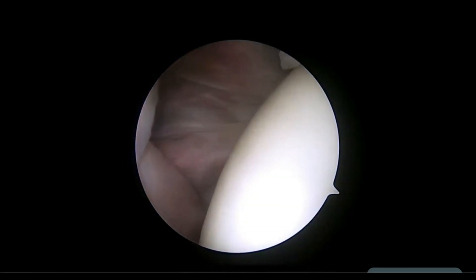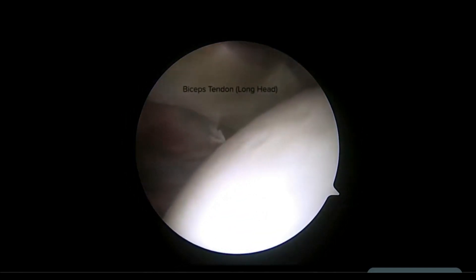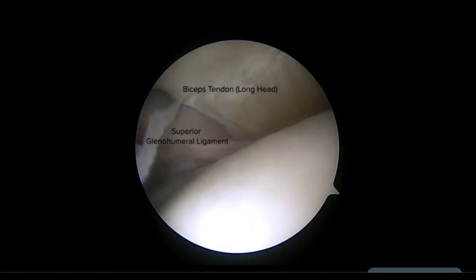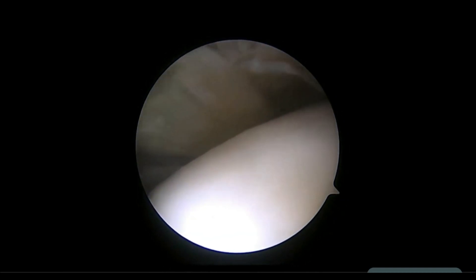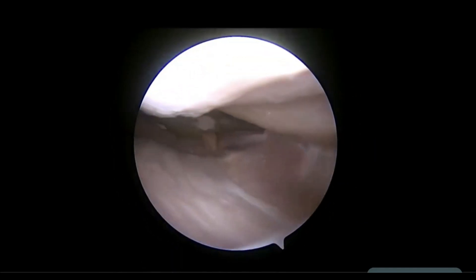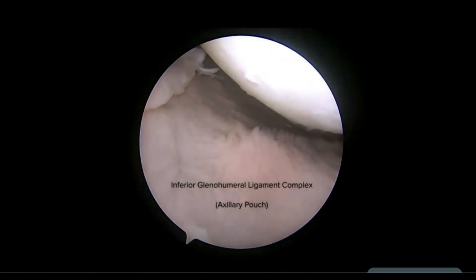Bringing the view back anterior, the rotator interval and rolled tendon of the subscapularis are visualized. The long head of the biceps is then seen as it projects into the joint from the bicipital groove laterally. In this view, you can also appreciate the superior glenohumeral ligament as it attaches to the humerus on the undersurface of the biceps into the groove. Finally, as the camera is driven inferiorly, the axillary pouch containing the inferior glenohumeral ligament complex comes into view, from its medial attachment on the glenoid through to the lateral attachment on the humerus.